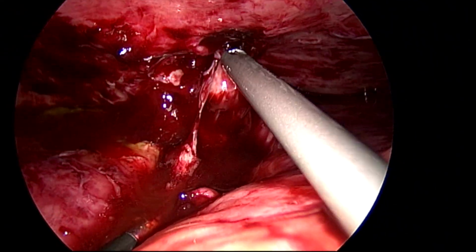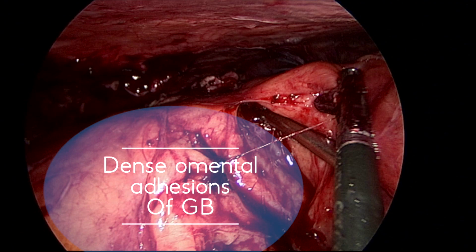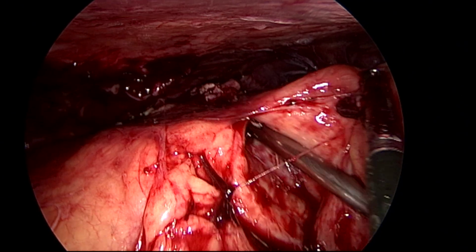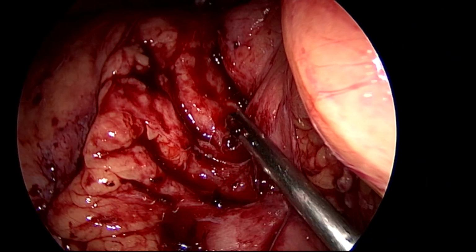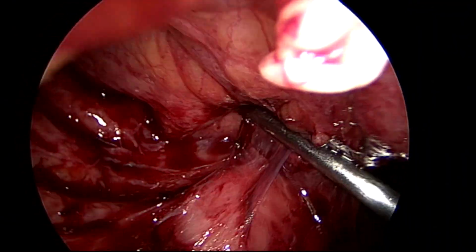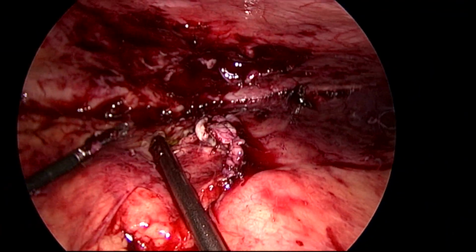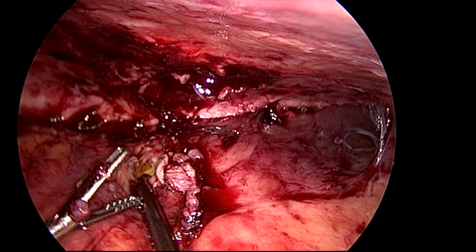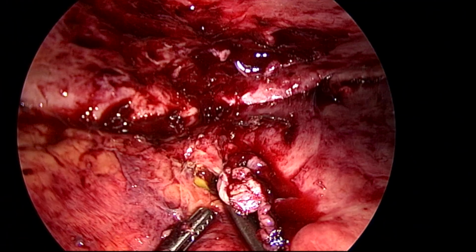All organized adhesions. So that area will be the gallbladder area. So the dense omental adhesions are there. The falciform is separated from the liver, and as I told in my previous video, the adhesions of the omentum, you have to take it from the quadrate lobe, that is the medial side. Quadrate lobe, you have to separate the omental adhesions, then only you can reach the gallbladder in a correct plane.